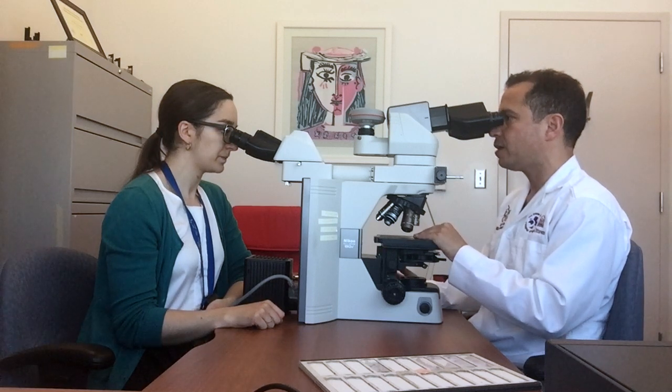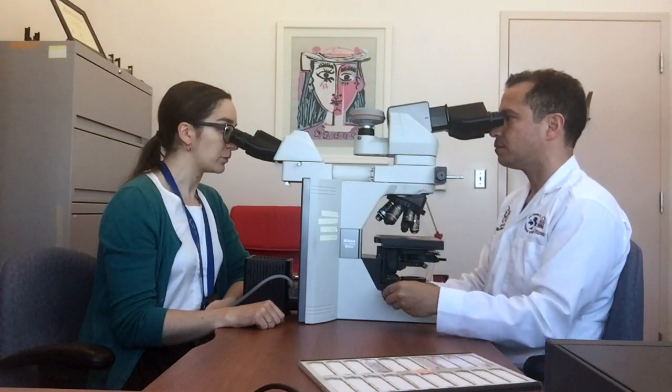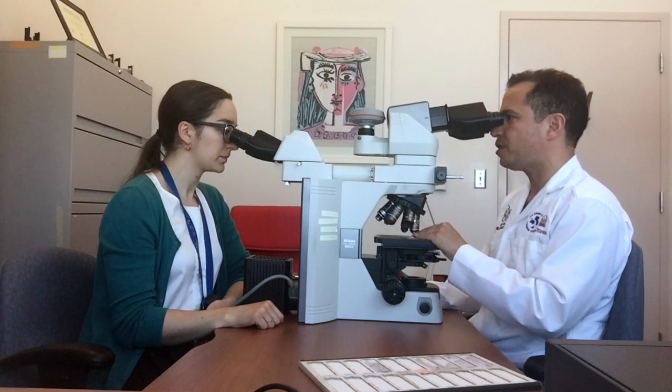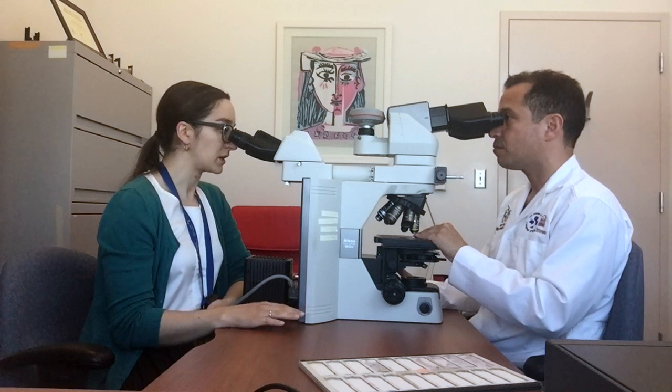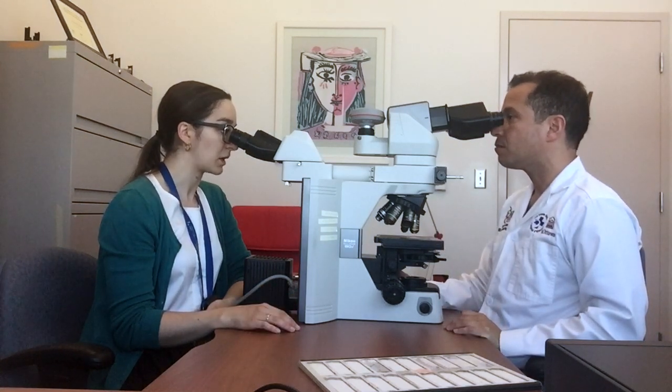Okay, yeah, I agree with you. And what information do you have about the patient? So I know that this is a 75-year-old man, and this biopsy was done for a lung nodule. Okay. And what's your differential here? So you're sure it's an adenocarcinoma? Yep. So is it a primary or a metastatic? Yeah, good question. Both of those are actually in my differential diagnosis. There's nothing cytologically or architecturally about what we have sampled here that clearly tells me that it's one or the other. So at this point in time, I have adenocarcinoma, but it could be primary, it could be metastatic, and I would want to do immunohistochemistry to figure that out.